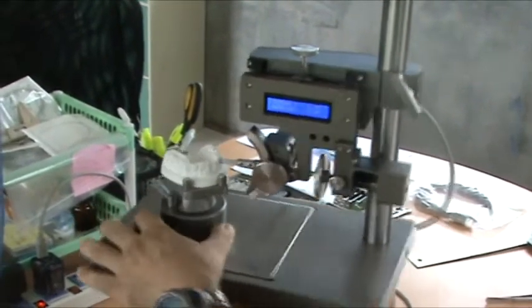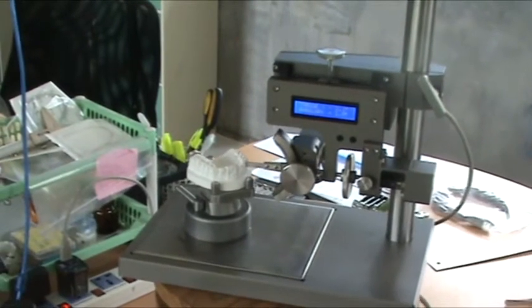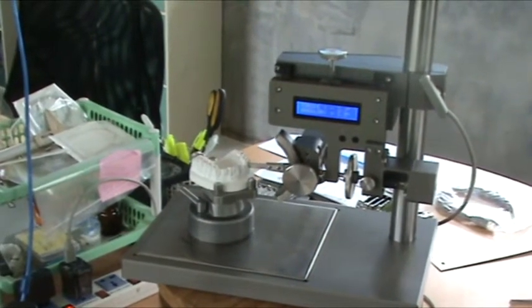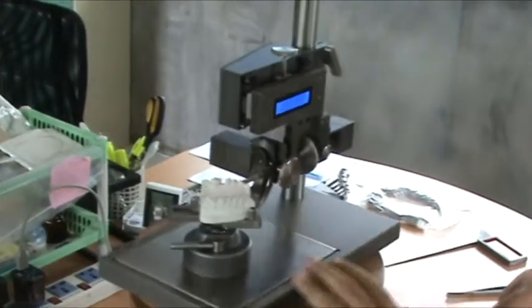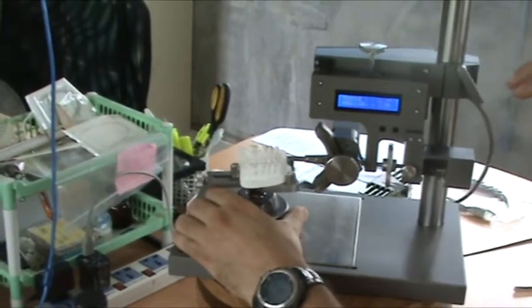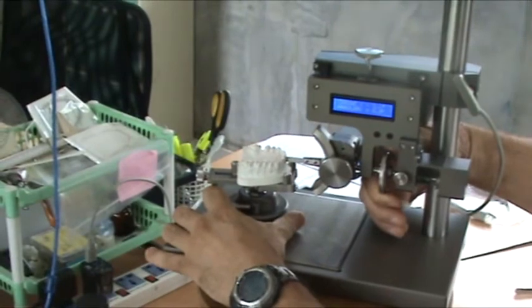That's quite upright. So you can use these values in your planning, your treatment planning, so that you can make a personalised treatment plan for the patient, not just stick to a standard chart. You can measure the teeth and then decide roughly how much you want to move them. So you have an idea before you start, what we started with, what's my goal. So if we come back to this side of the arch, it's wrong now because the tip is wrong, so I just press it again and now I can measure 21.